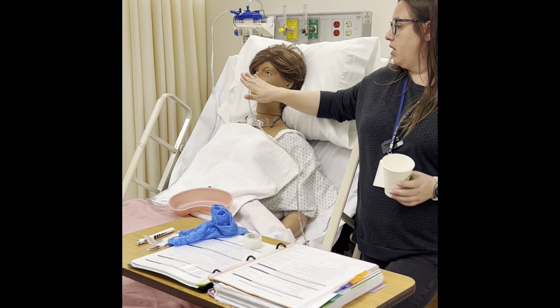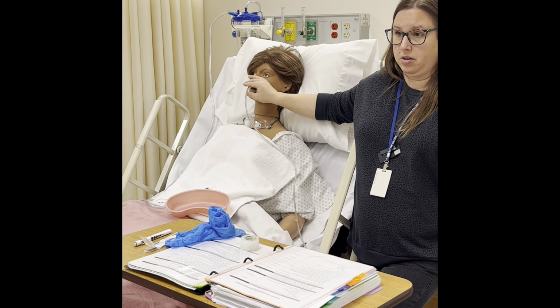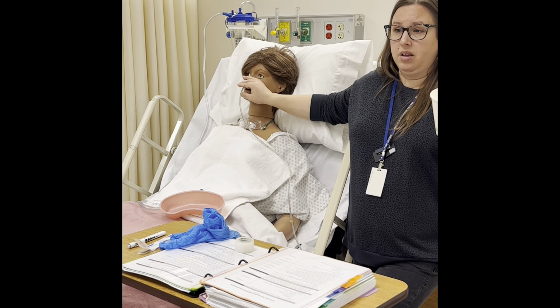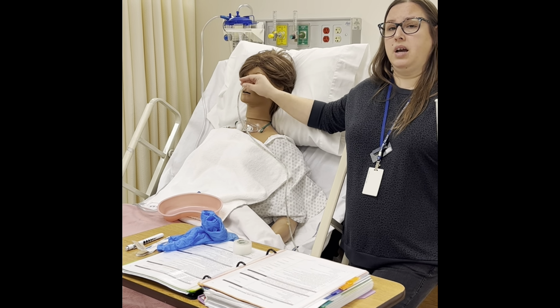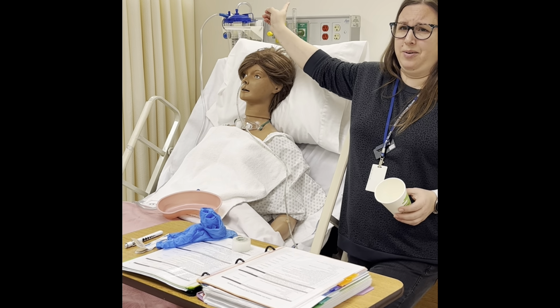This water though, if they're getting this tube for gastric decompression, they're NPO, they are not getting any water anymore. This is kind of a false sense. Plus any water that they get that they think is helping them, we're just going to suck right back up the tube.